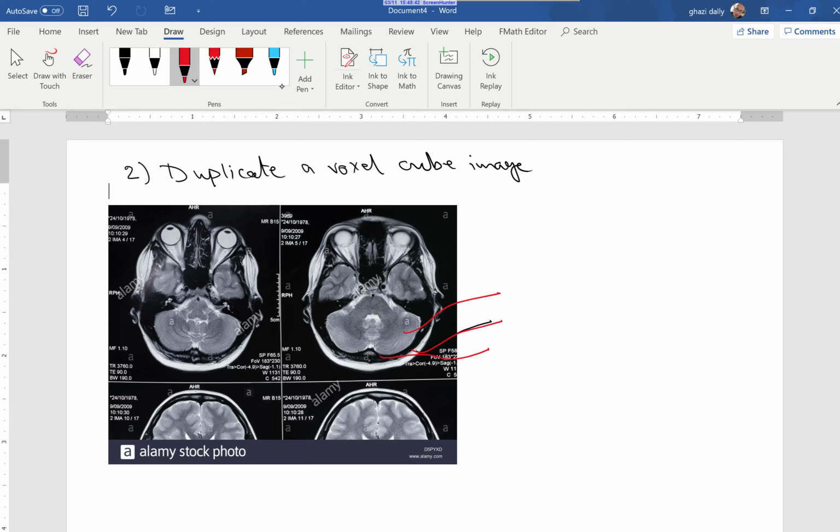Now, if we divided this small part here into 4 squares, and we associate each square with a number that represents how strong or weak the absorption is. Let's say that we associate this square with 3, and this with 4, this with 8, and the other with 5. The smaller the number means the more absorption.